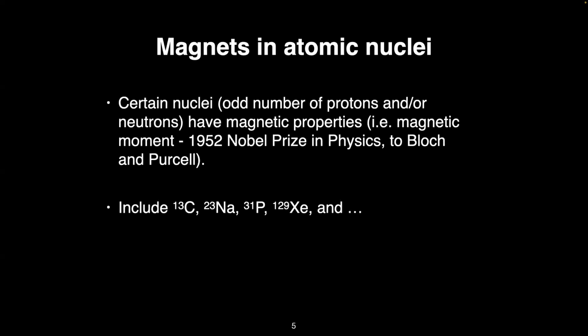Anybody online? And that is absolutely correct. Someone online did mention hydrogen or protons. And that's important because these make up water, and that is pretty much in every single part of us, except maybe our lungs. But the hydrogen atom, or the proton nucleus, is what we use to generate the signal that we're seeing.